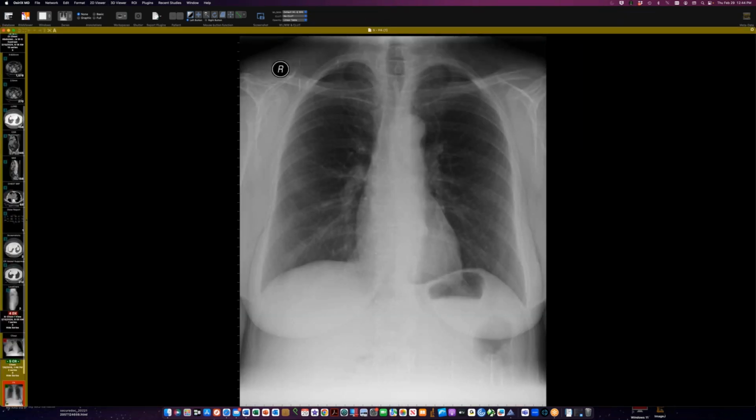So David, how many satisfactions of search do we get before we use them up? You know, it turns out that just picking up one abnormality sort of turns off your sensitivity to remaining abnormalities. So I think the biggest impediment to detecting a left pneumothorax is having detected a right pneumothorax. Once you've done that. That is probably true. Yeah. So satisfaction of search is not necessarily your friend.